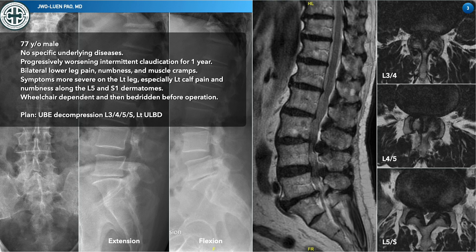In this video, I'm going to show you the part where I used the osteotome to do the decompression, and after I used the burr to complete the bony work. Please enjoy the video and leave me your comments below. I will appreciate it. Thank you.